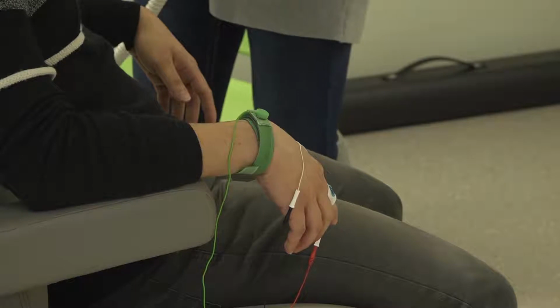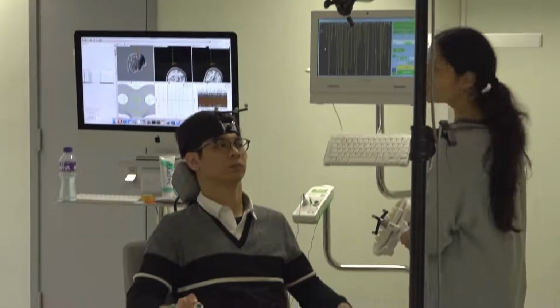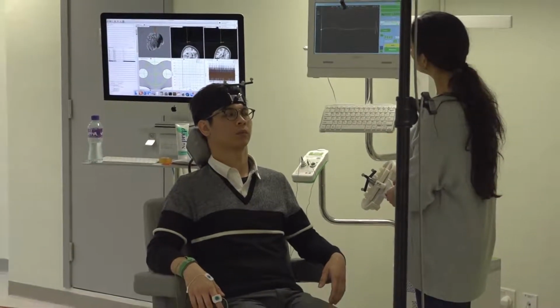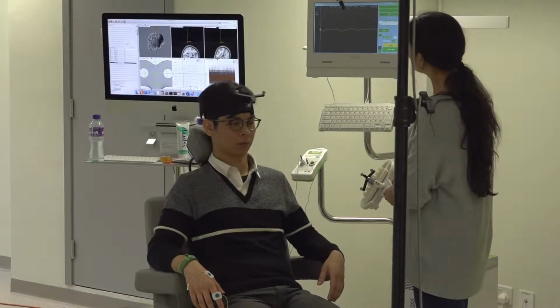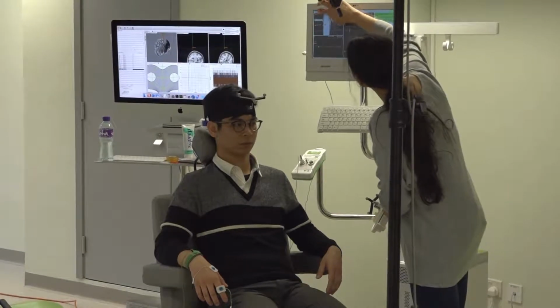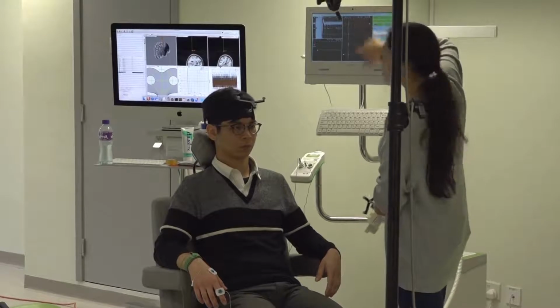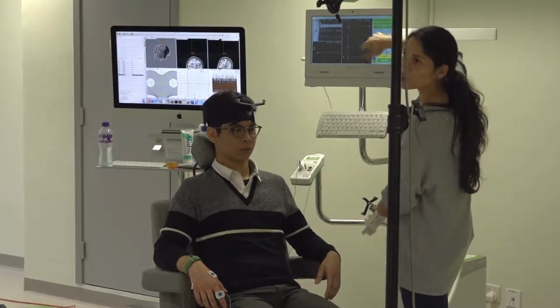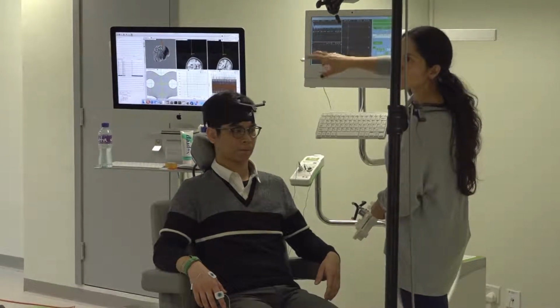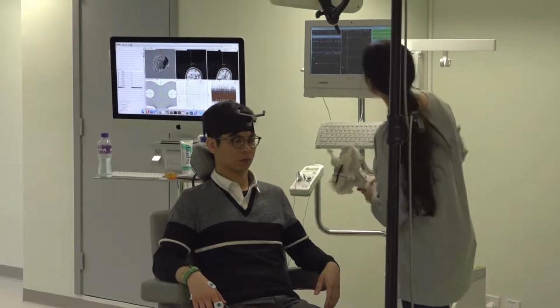Okay, so here we're seeing his EMG. Do a fist. And then you see how it changes. Relax. I am selecting just this, so you also have some information here, but I think it's just so noisy. Here you have the history so that you can see the collection of MEPs that you are getting. But I just want to use this screen because it's just one, and then we can focus better.